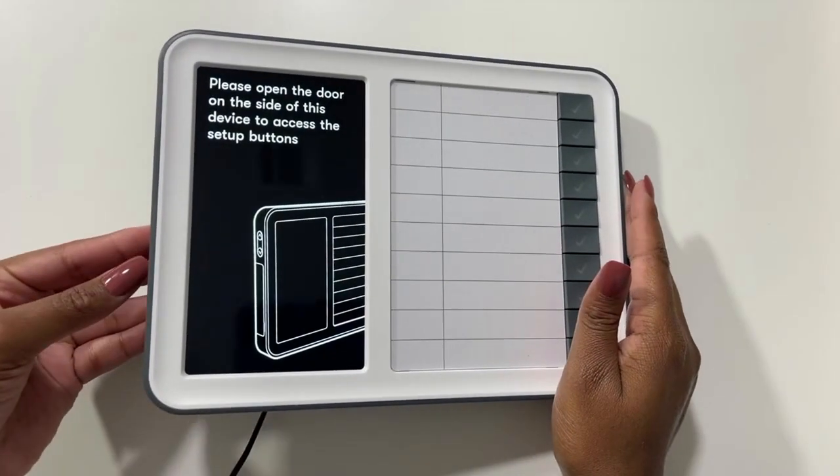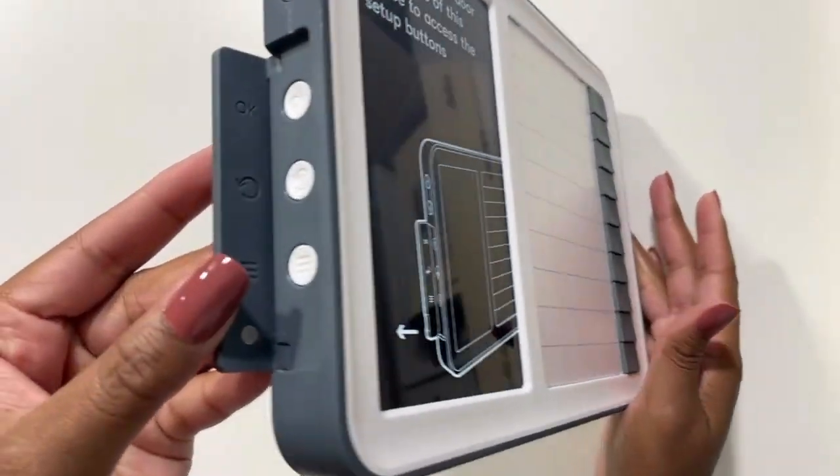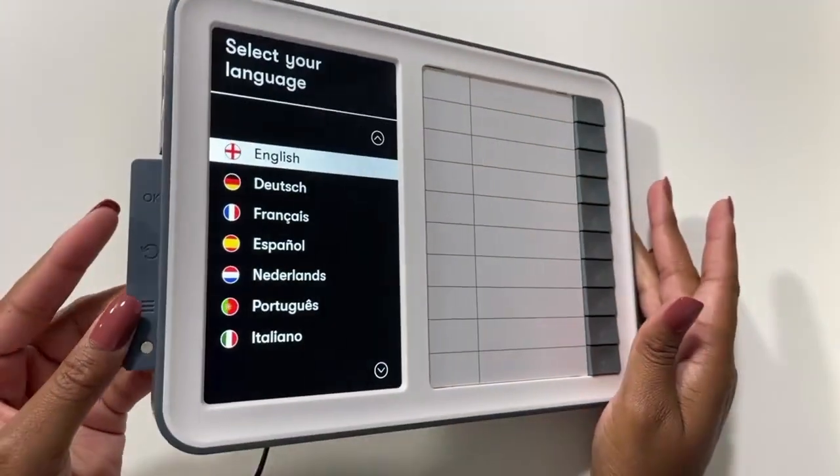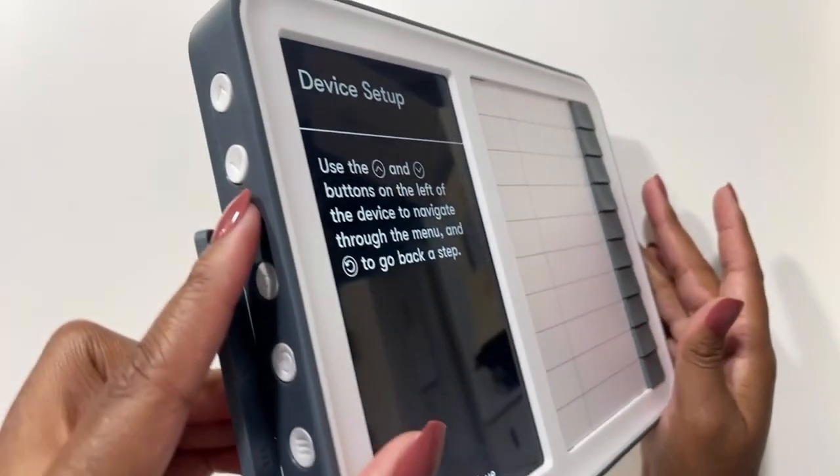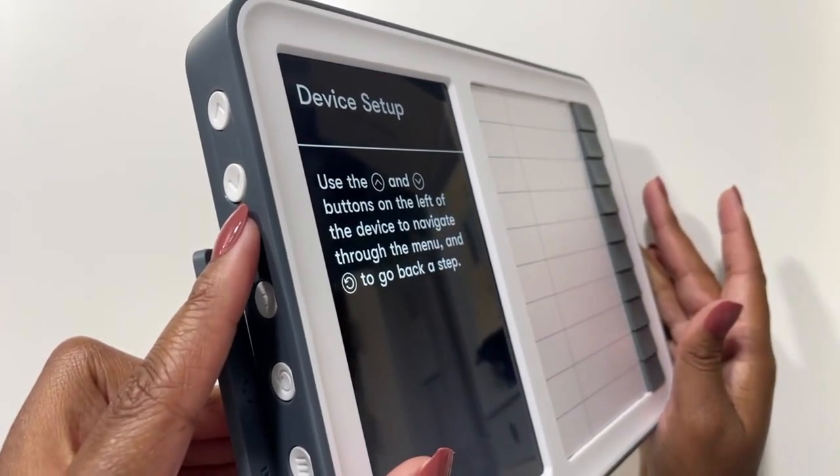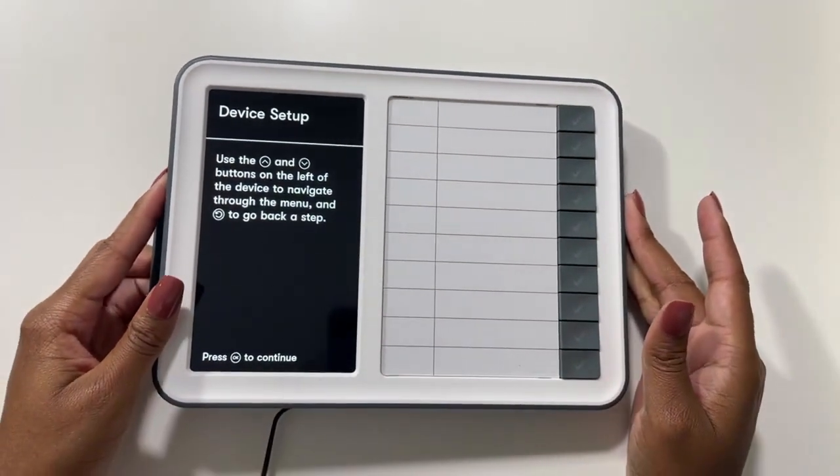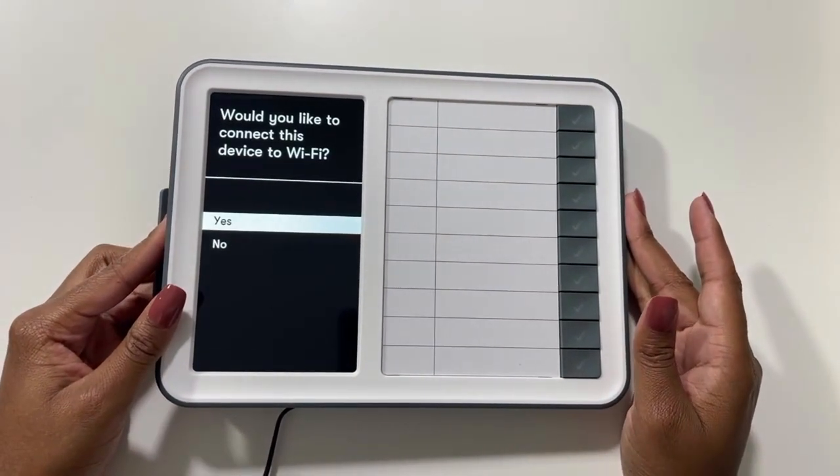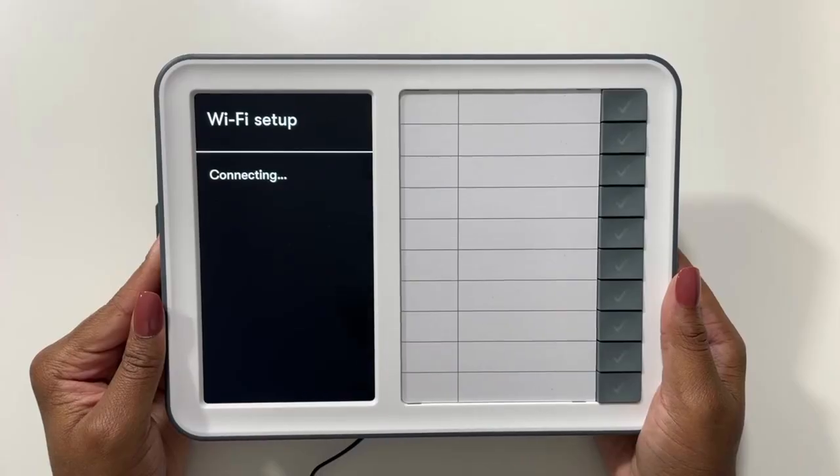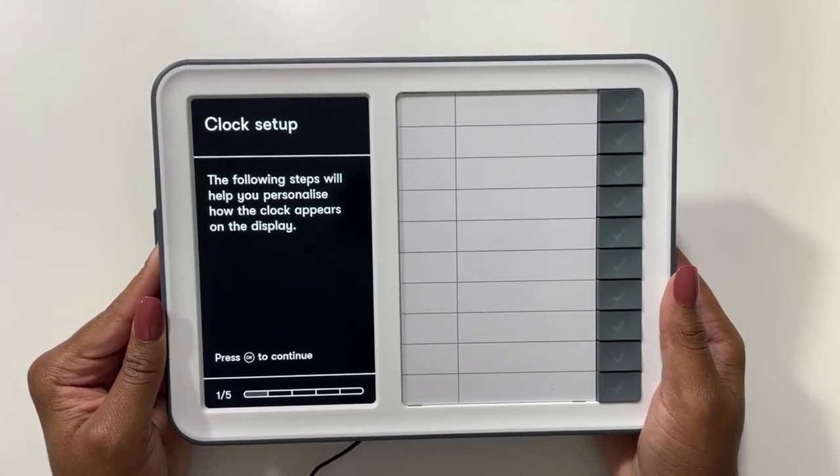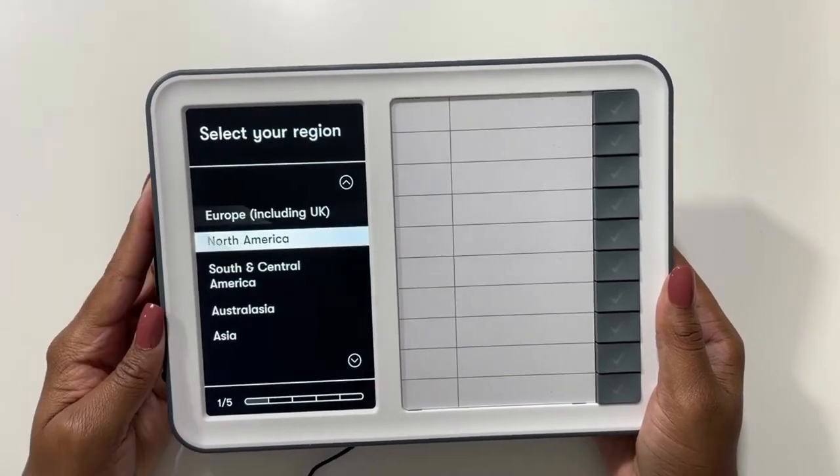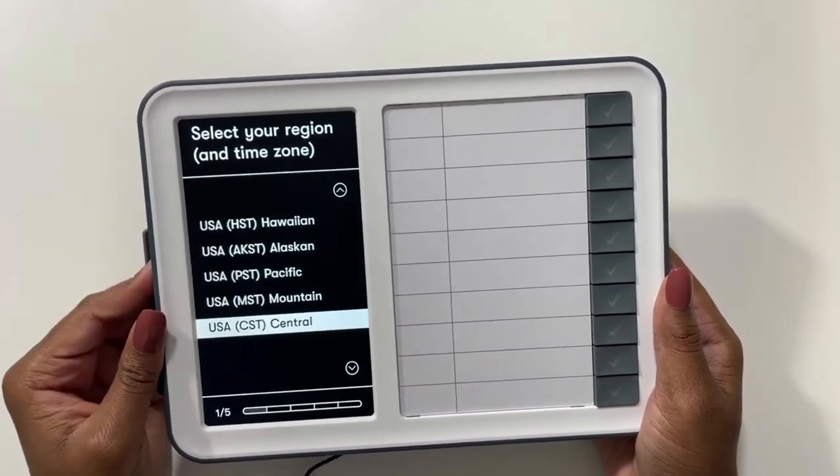On the left side of the device, we'll find a flap that we need to pull out to reveal three buttons. Now we'll select our language. You'll find the arrow buttons at the top left of the device. Next we'll connect it to Wi-Fi if we have it, then follow the prompts to set up our time and how we want our display to look.